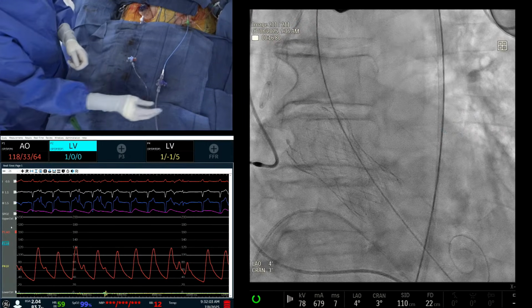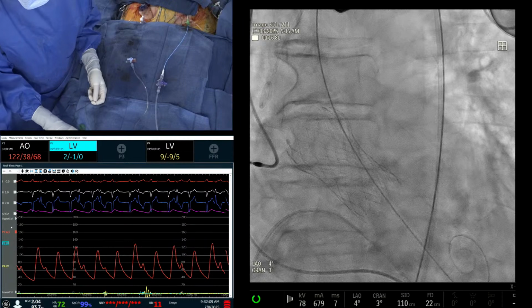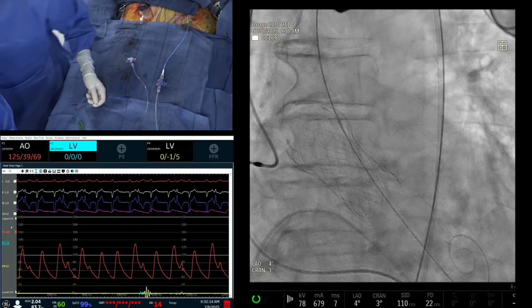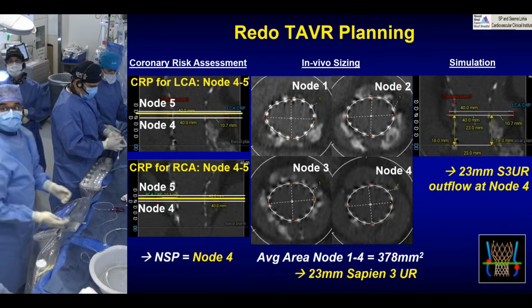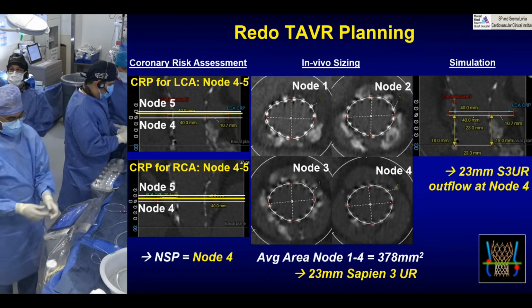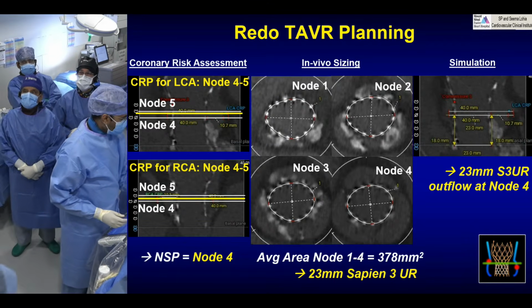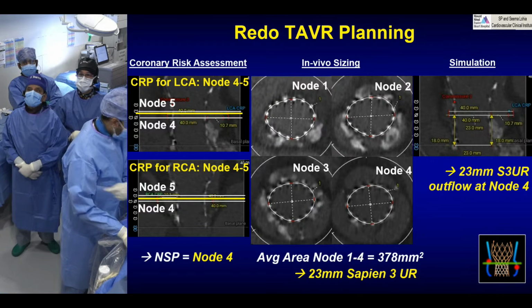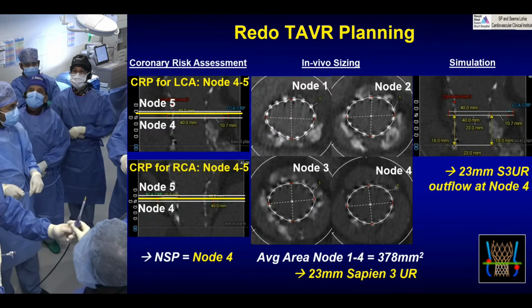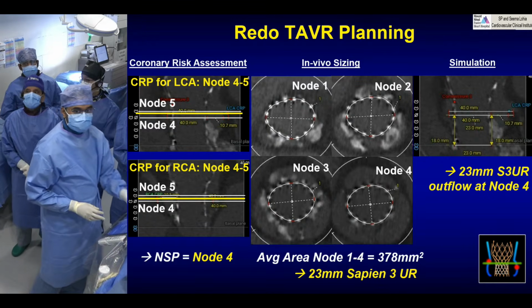The only issue is you have 4 areas of nodular calcification. So I think first trying to reinforce the valve frame with a redo, if we can get it done. If not, then we'll think about closure. He probably just joined. Yeah, this is the key here. So what Sam looked at on echo, and here is no 1 and no 2 on this particular image. You see on the 6 o'clock area, there's a gap. And the valve is not circular. And remember, this is a 29 Evolut valve. The no 1, no 2 are grossly underexpanded. It's only around 23, 24. So that's where the calcium is impinging, impeding the frame from expanding more optimally.